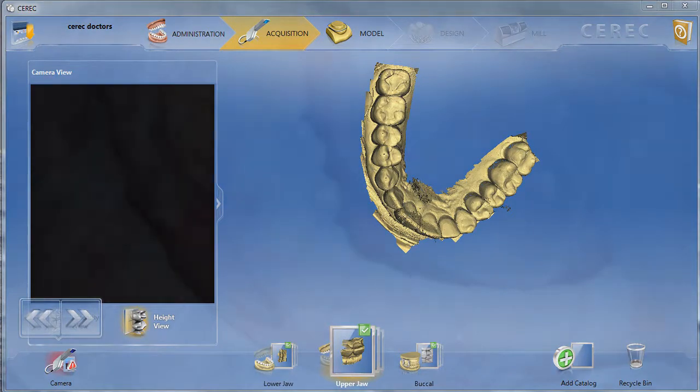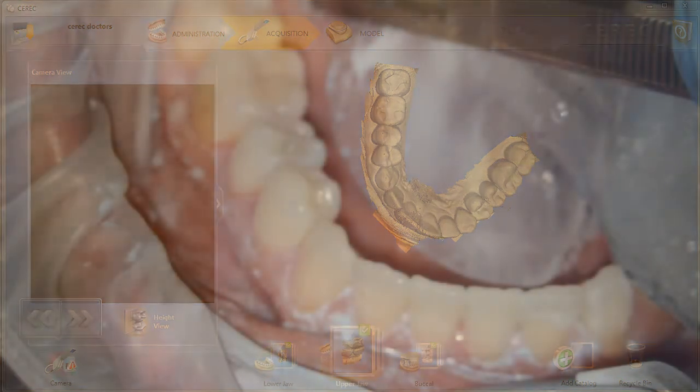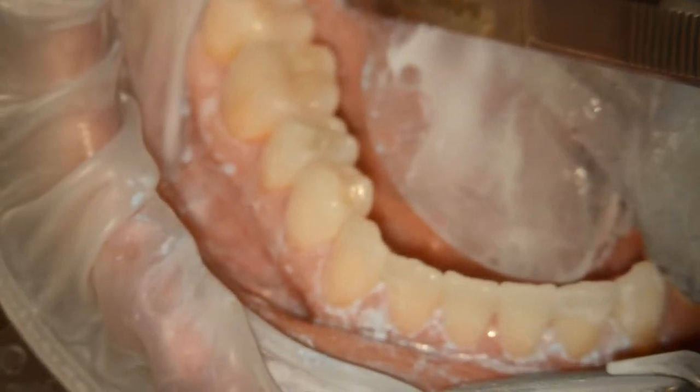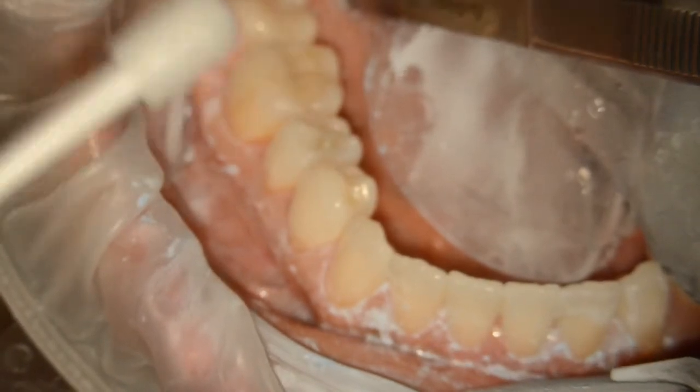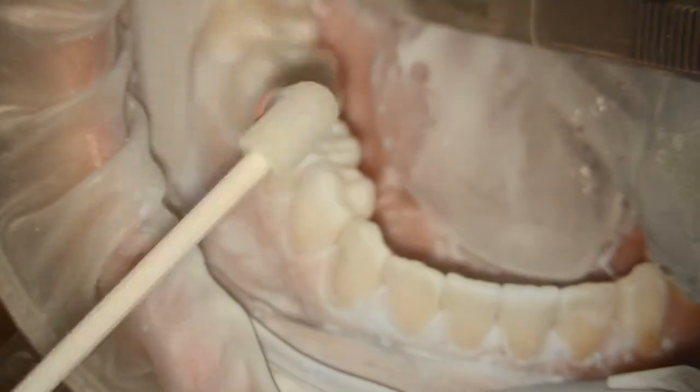Let's go ahead and do the same for the lower arch. We've got the isolation in place, and we're going to dust and powder the lower arch on the right side. You'll notice the Isolite is placed all the way to the canine, so we've got good retraction. Ideally, we could have used a deep vestibule Isolite here, or maybe even a large one, to really displace the tongue.